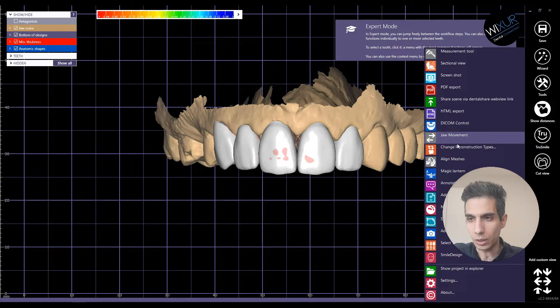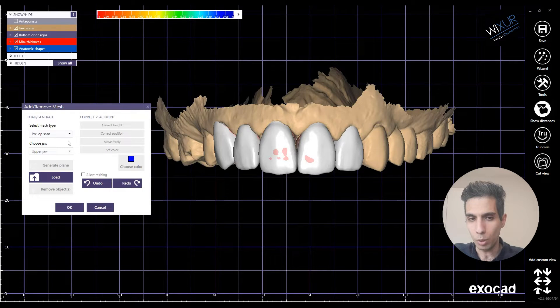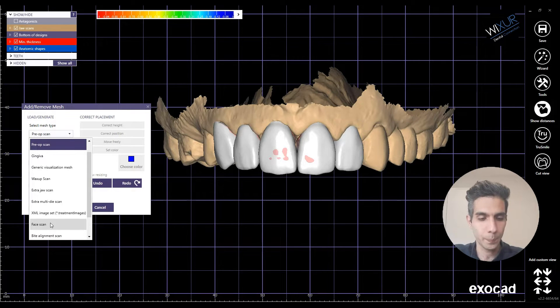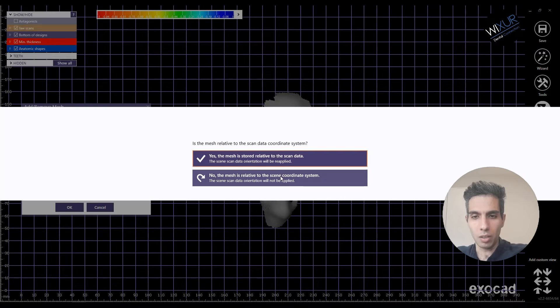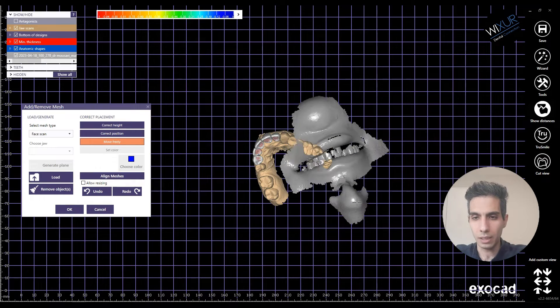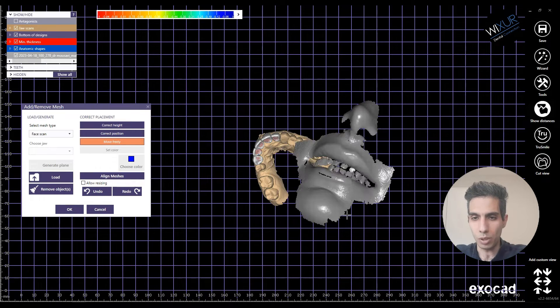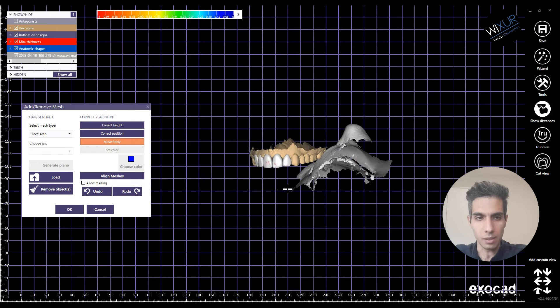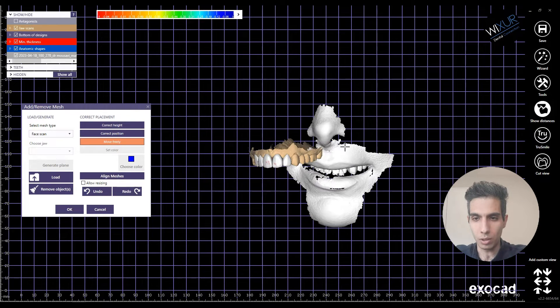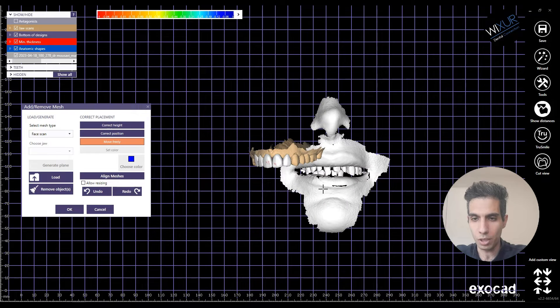Everything I'm doing here is in the tab simple, no chain mode, because it's not needed. Okay, let's go to the expert mode tools. What I'm going to do is add/remove mesh and import the face scan that I got from the dentist. Here we are — this is the face scan we are going to work with. Now it's time to align this mesh with the previous one, which is my upper jaw.